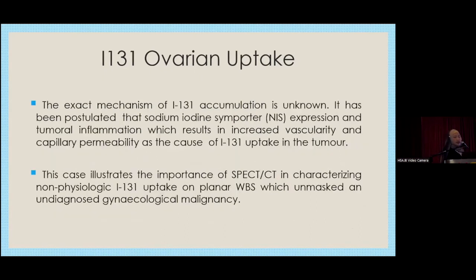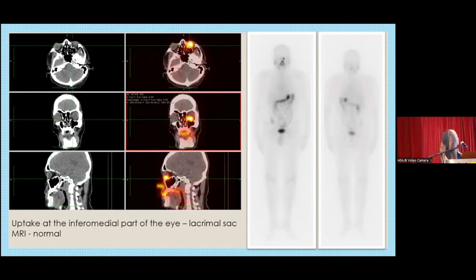another malignant disease. The exact mechanism of uptake of iodine, we don't know, but it is believed to be because of sodium iodide symporter expression that can occur in the uterus or ovary, and also because of tumoral inflammation which results in increased vascularity and capillary permeability. So this case illustrates the importance of SPECT-CT in characterizing a non-physiologic iodine uptake on planar imaging, which unmasked an undiagnosed gynecological malignancy.